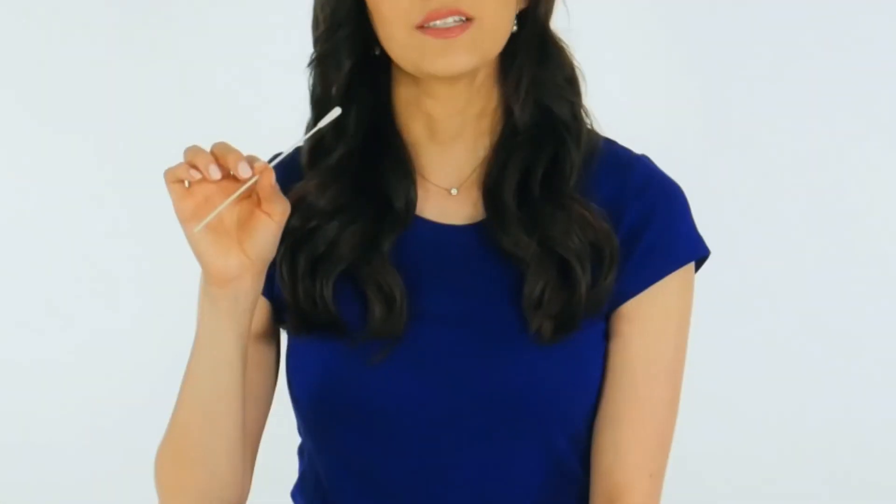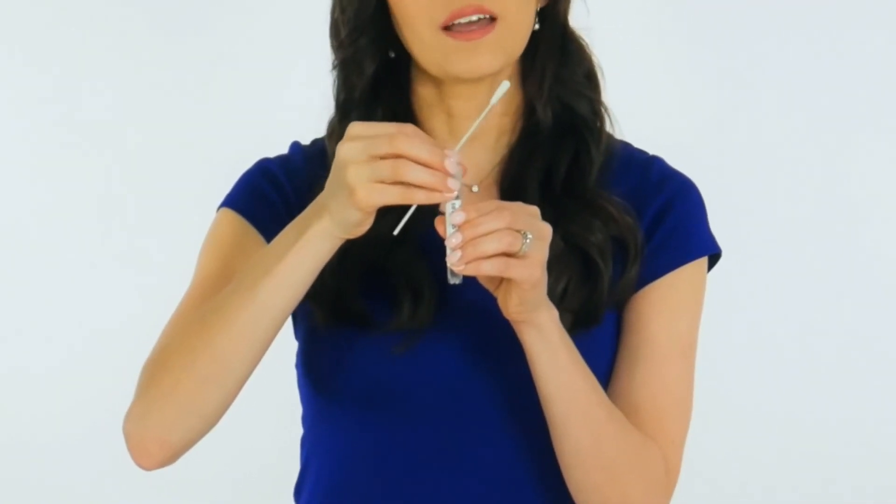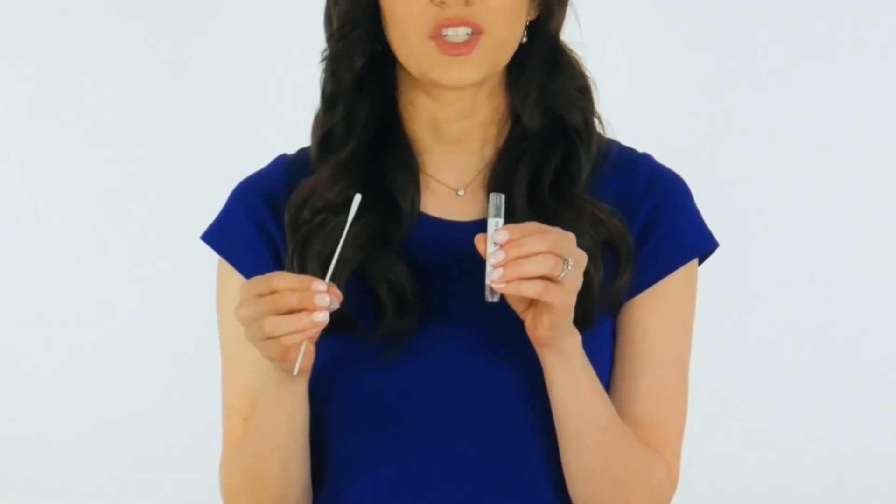While holding the swab in the same hand, unscrew the cap from the tube. Do not spill the contents of the tube. If the contents of the tube are spilled, use a new swab specimen collection kit.